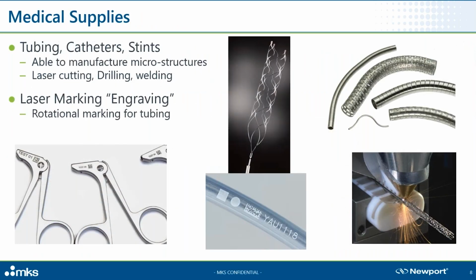Let alone new surgeries, historical surgical methods use metal clamps, stents, plastic tubing, etc. This equipment, implantables and disposables, are almost all laser manufactured, processed, welded, drilled, and engraved. It all needs to be labeled and maintain sterilization. Laser printing a barcode on a tubing is a no-brainer. I know job shops whose sole business is to fabricate welded stents and catheters that are sold to hospitals and other medical facilities.